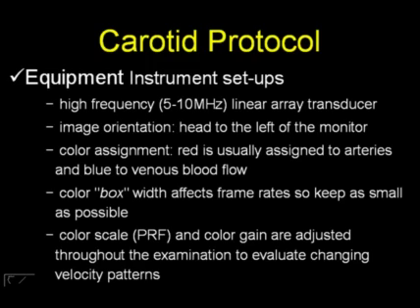Now, as you know, in terms of color flow assignment, any flow toward the transducer can be set as either red or blue. In our facility, and I think by convention in most vascular laboratories, we typically assign red for arteries and blue for veins just for consistency.